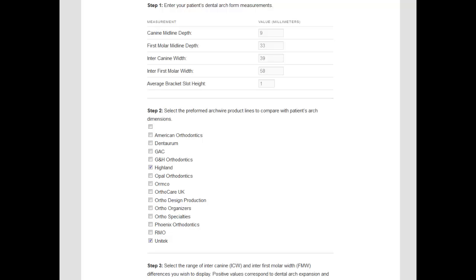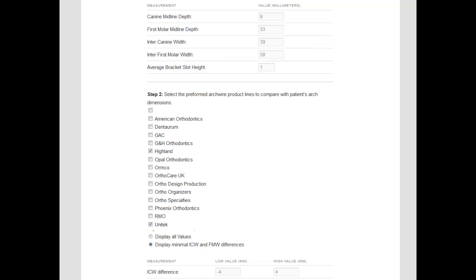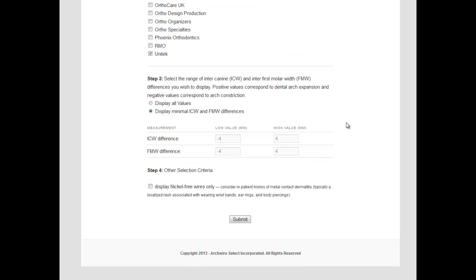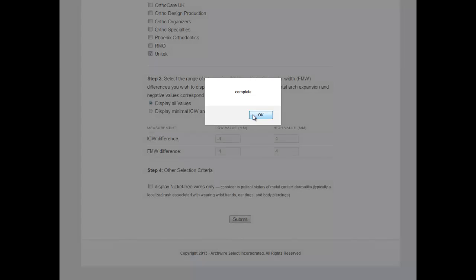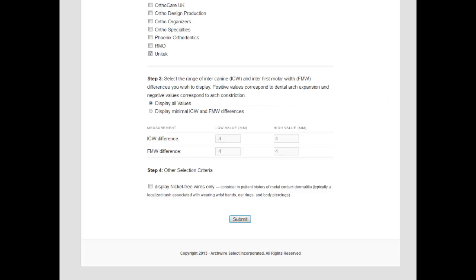In the third section, we instruct the application to show results for all Highland and Unitec arch wire types. Finally, we leave the nickel-free checkbox empty. Hitting the Submit key sends the form to the website for processing.